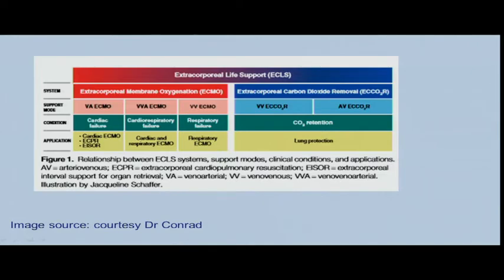Basically the function for the ECCO2R is to remove carbon dioxide, especially in patients that are hypercapnic. So ECCO2R is used for lung protection. And for ECMO, we use it for cardiac and respiratory support. So you can use it in patients with cardiac failure, respiratory failure.